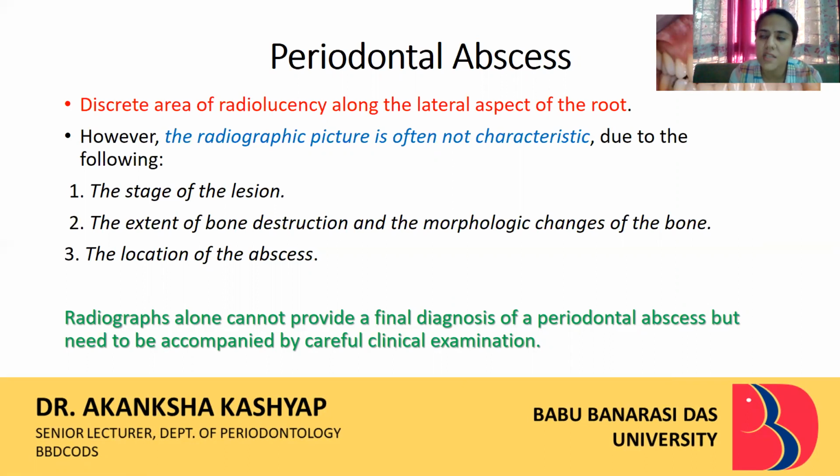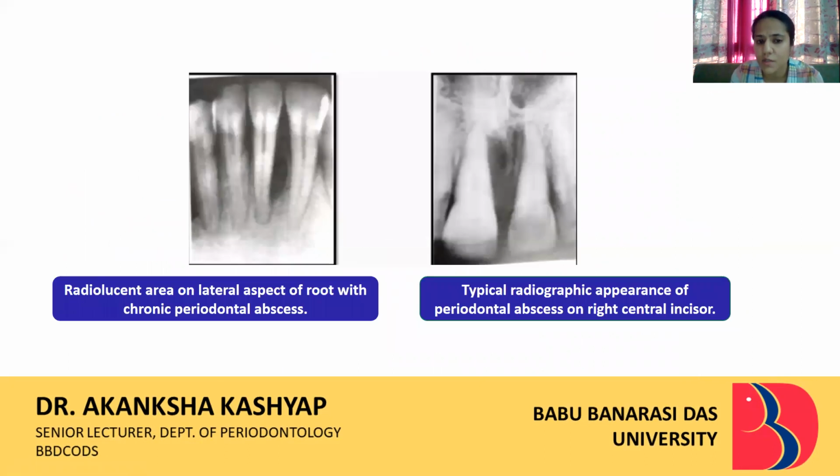The periodontal abscess in the initial lesion, although it is very painful, is not evident on the radiograph initially. Also, it depends upon the extent of the bone destruction, the morphologic changes of the bone and the location of the abscess. If the abscess is in the soft tissue, it is very difficult to appreciate on a radiograph, because as I've told you, radiographs do not clearly capture the changes in the soft tissue.